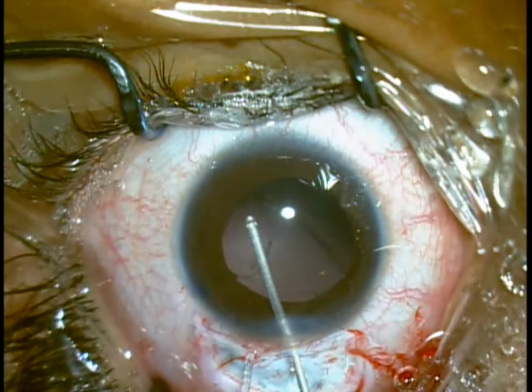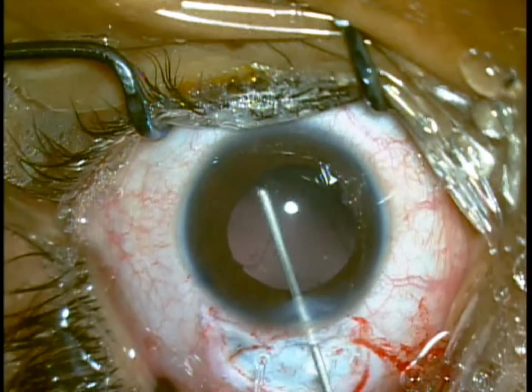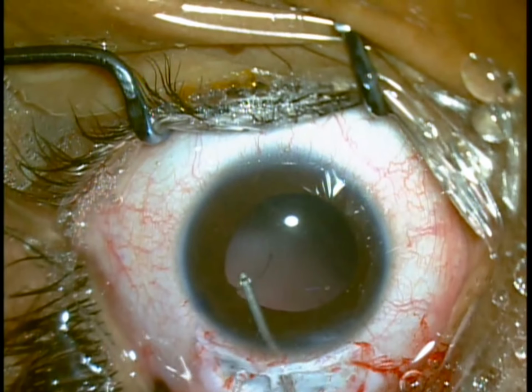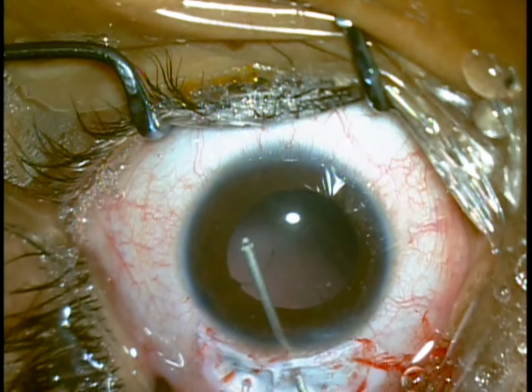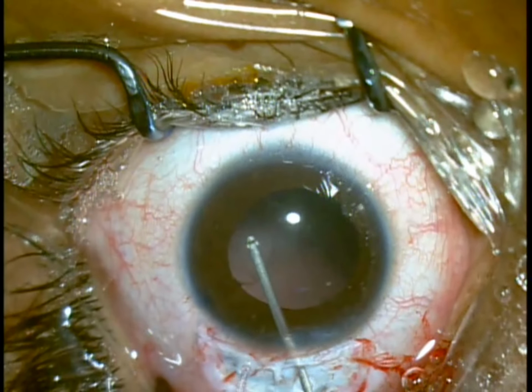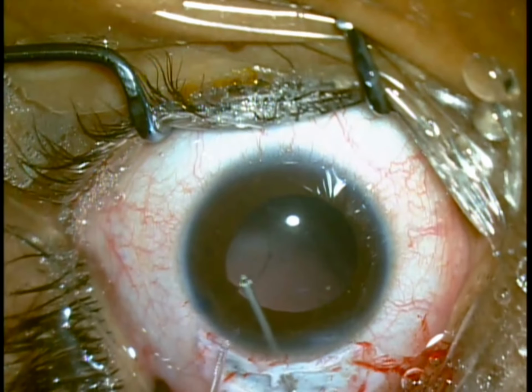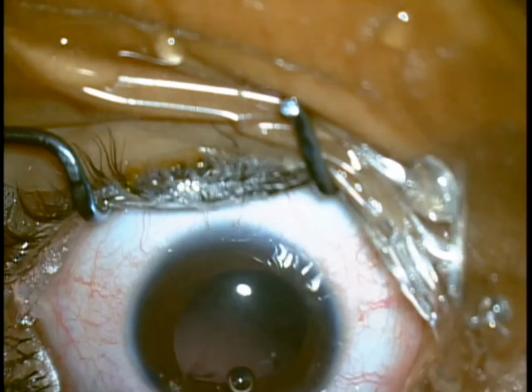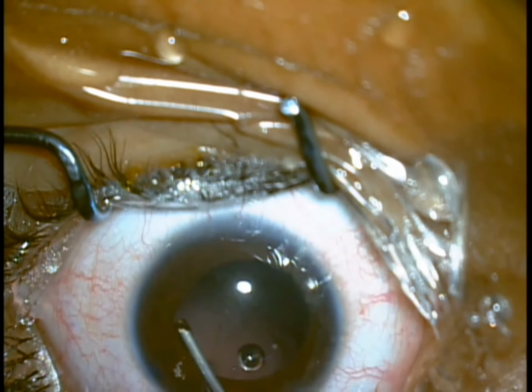A thorough anterior vitrectomy is done. The cyst is not completely removed at this point.